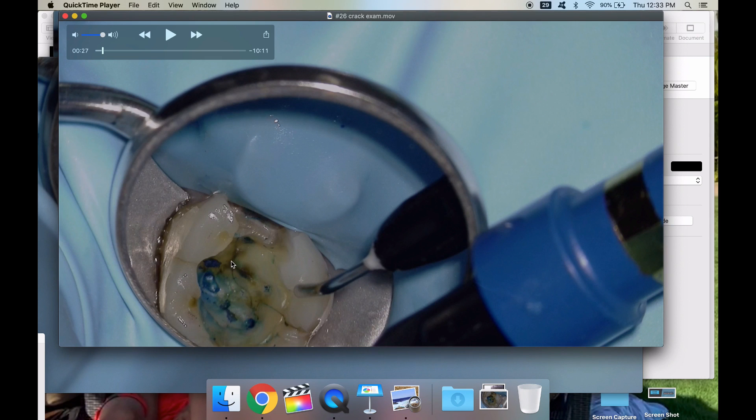On the x-ray it's really interesting — you can actually see in the PA there's a crack that's buccolingual, which you never see; it's usually mesiodistal. That's why I wanted to post this case. Normally, maybe 15 years ago when I got started, I'd aim for these to do the root canal — and we're doing the root canal because the pulp chamber is literally right there.